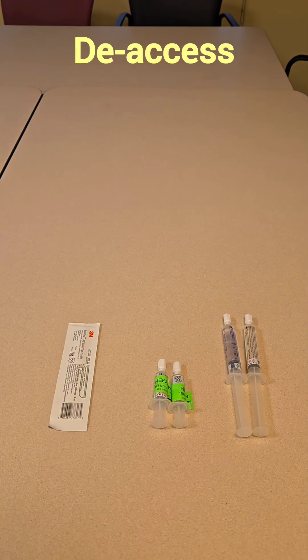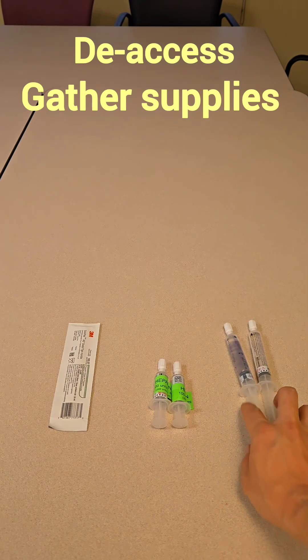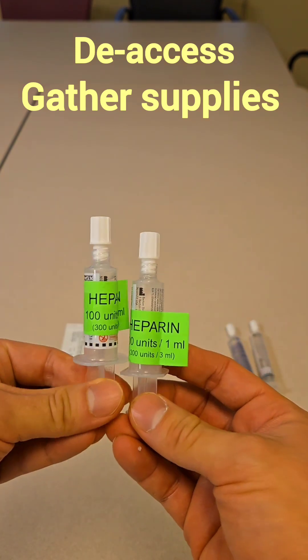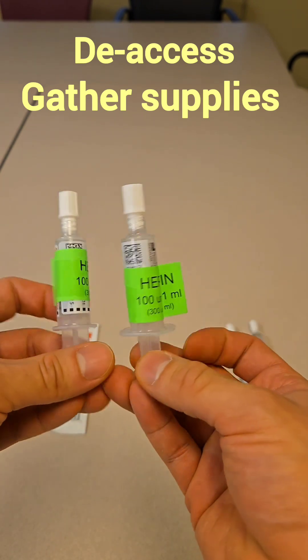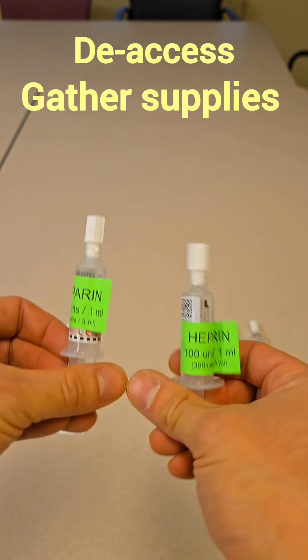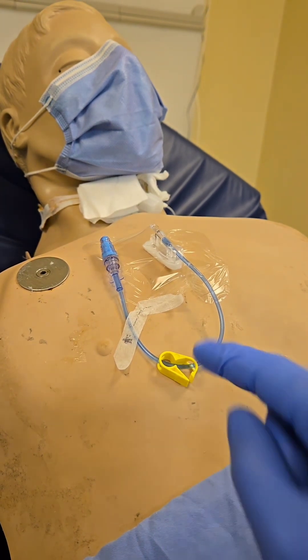To remove our portacath, let's start by gathering supplies. We're going to use a chlorhexidine stick, saline flushes, and heparin locks. In our institution we lock our portacath with 500 units or 5 cc's. The heparin usually comes in 300 units per 3 milliliters, so you need two vials and you will waste 1 milliliter from one of them — since each vial has 3 cc's and we only need 5. Now, prior to removing, make sure the patient has a mask on and perform hand hygiene, then put on gloves. Start by removing the dressing.